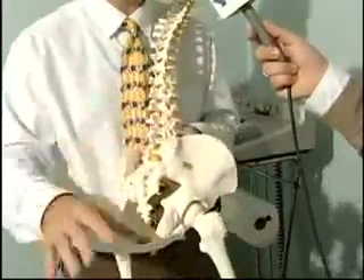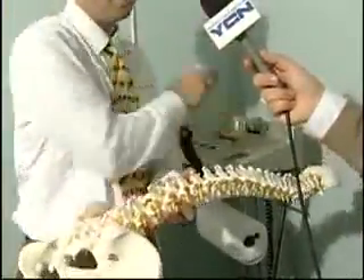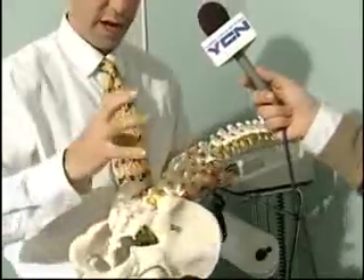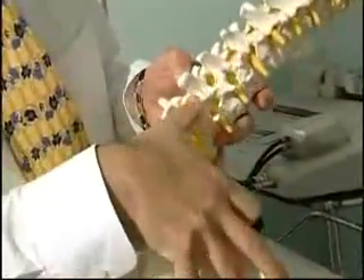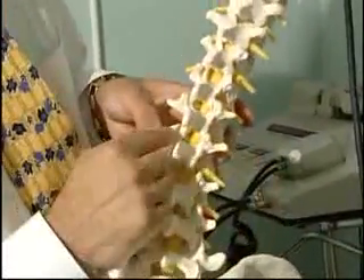This spinal mobilizer works by having the person lay on their stomach, which stretches them out a bit, and then I use a handheld device to go up and down the spine. It has four prongs, two coming out at a time. When I press on both sides of a joint, it opens that joint up. I can go up and down the spine multiple times over 45 minutes, increasing flexibility and mobility throughout the whole spine — taking pressure off the painful area. People who've had pain going down their leg after four to six treatments have had that pain go away, and their back pain significantly decreased.